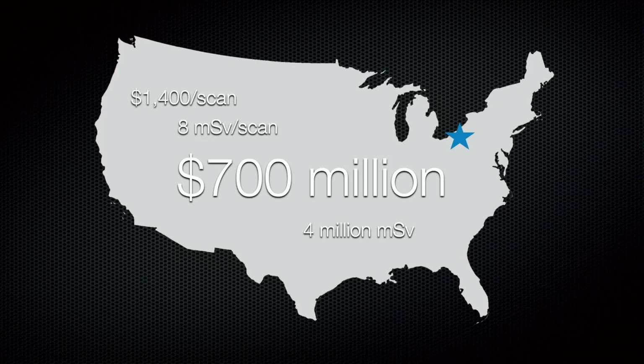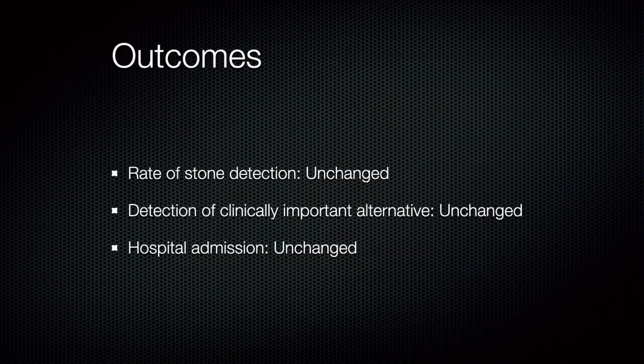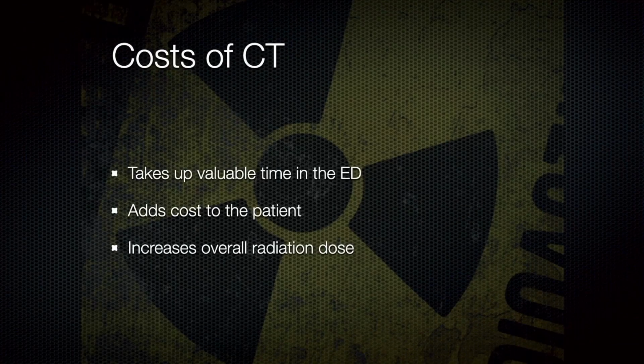Because radiation does have its downsides, and there's appropriate utilization of healthcare dollars as we apply it to patients, right? And so what we found over the course of that time period, in the study, is that the rate of stone detection was relatively unchanged. The detection of clinically important alternate diagnoses was relatively unchanged, and the rates of hospital admission were relatively unchanged. But we had a significant increase in the number of scans performed, which increased costs and radiation. And so it takes up valuable time in the ED. It adds cost to the patient's bill and increases their overall lifetime radiation dose.